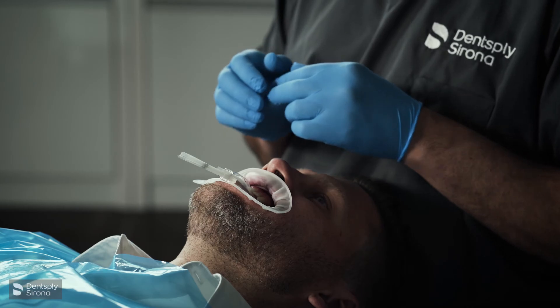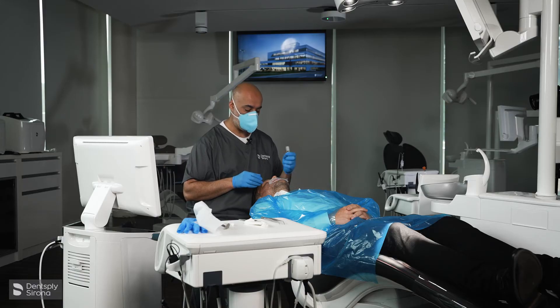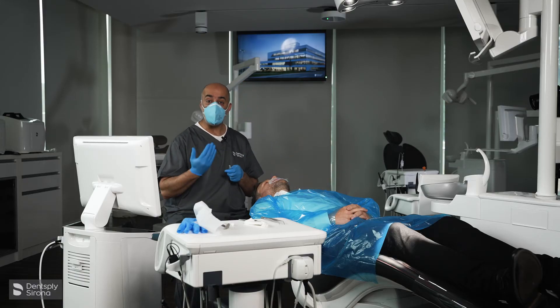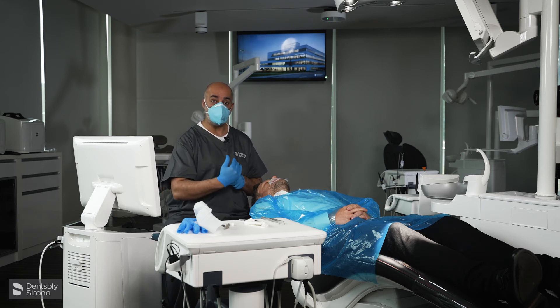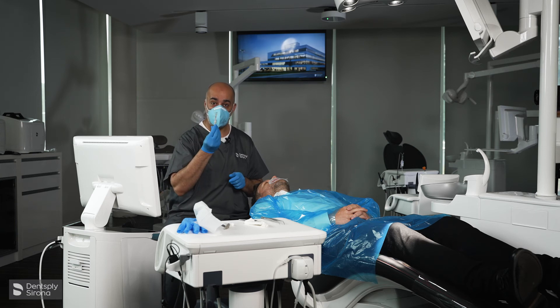If I'm increasing the vertical dimension for restorative reasons, I will sit the patient upright and do exactly the same process.